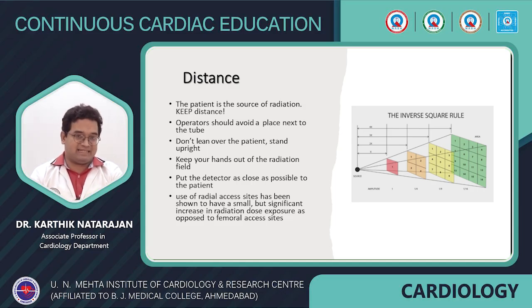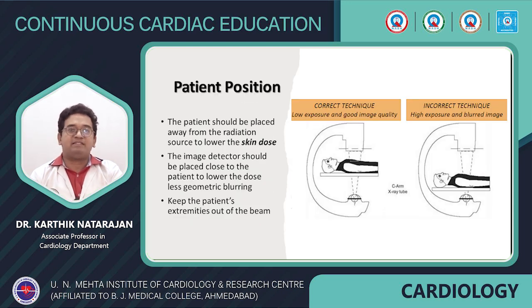Now, I'll show you in the next slide. Although radial, for all practical reasons, has replaced PCI through the femoral route, studies have shown that radial access tends to have a small but yet significant increase in the radiation dose exposure. Now, this is the patient position.